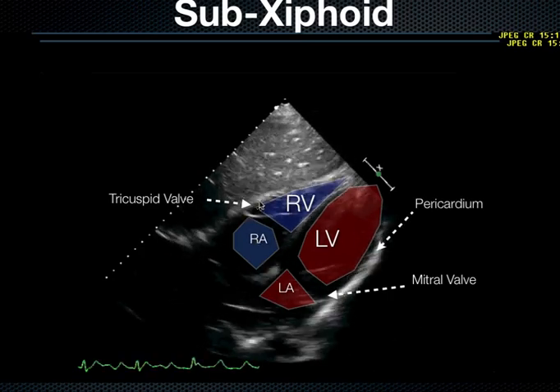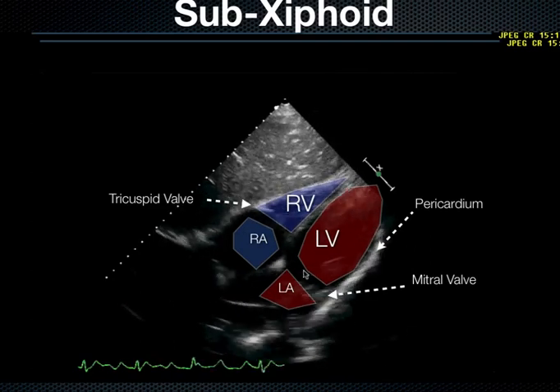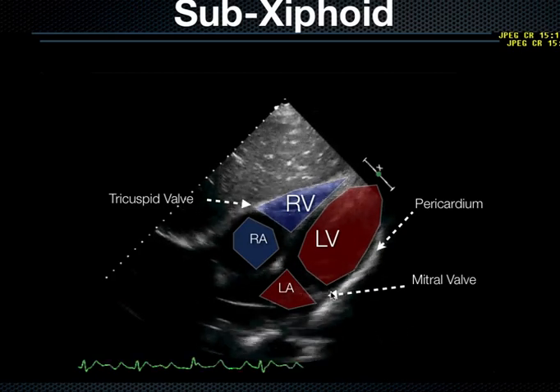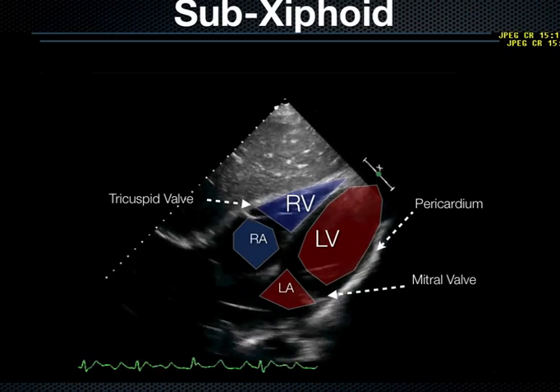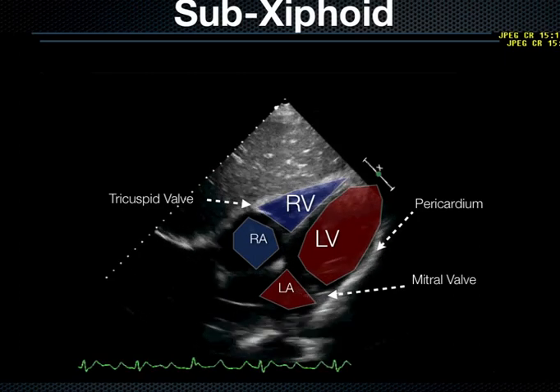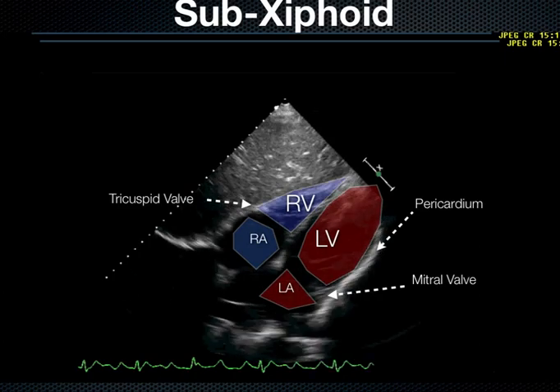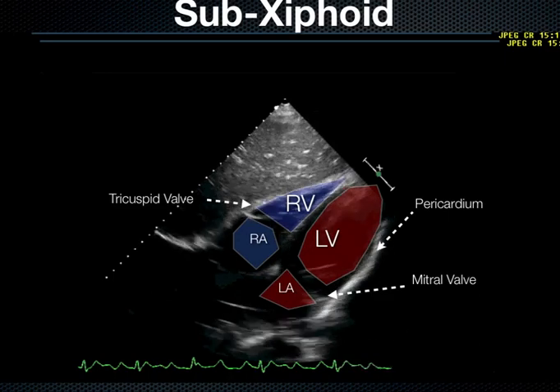Okay, this is that anterior pericardium over here, and then the posterior pericardium is down here. And maybe there's a little mitral valve here and tricuspid valve here. But really, this is the best view in order to see two things. Number one, I use it when a patient's dead and they're coding, they don't have a pulse, and I want to see, are they really dead or not? I want to see, is the heart actually standing still, or is the heart moving? You'd be surprised how many times somebody doesn't feel a pulse, myself included, but when I go to look at the heart, it's actually moving.